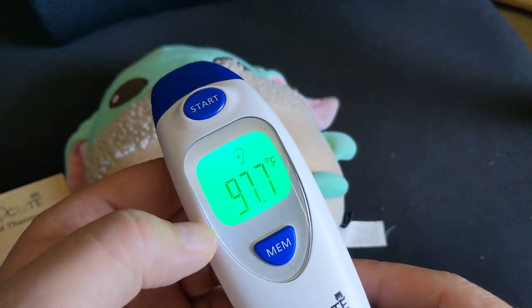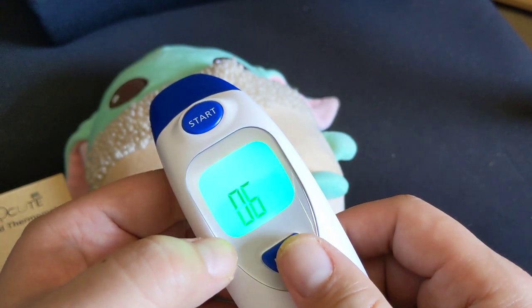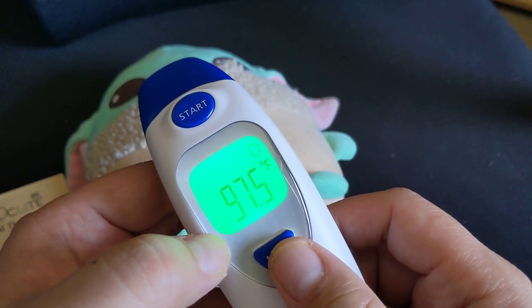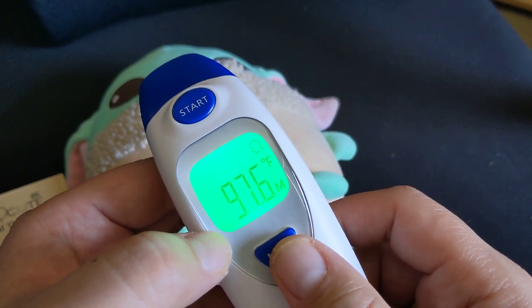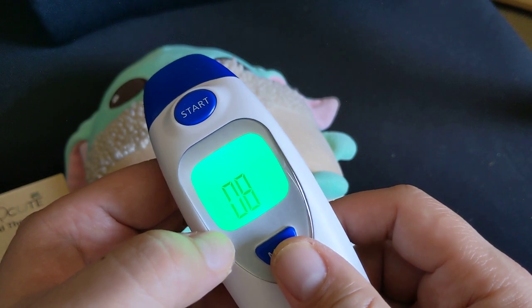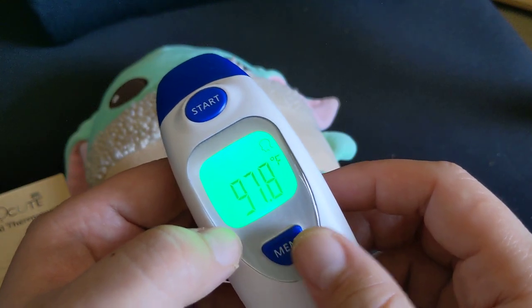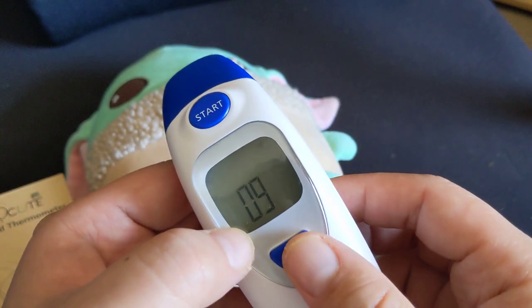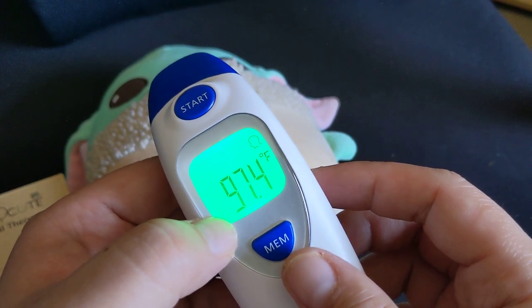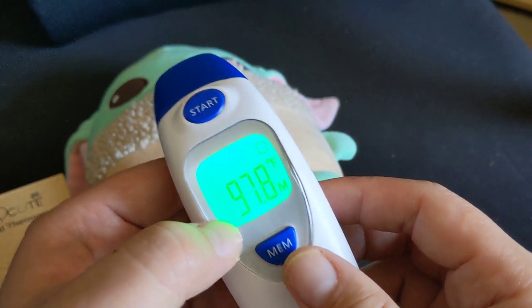You can see the ear readings range anywhere from 97.5 all the way to 98. When I use the infrared for my forehead — either touching or non-touching — it's a little more accurate when touching. When touching, I got 97.8, which is off by 0.8. When not touching my forehead, it was off by 1.2.